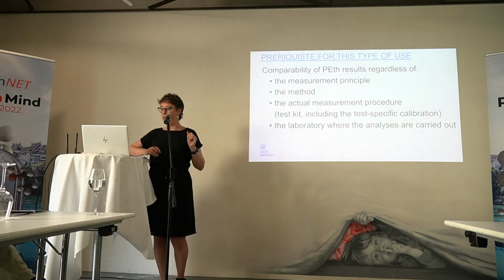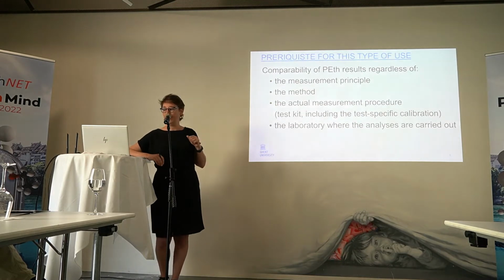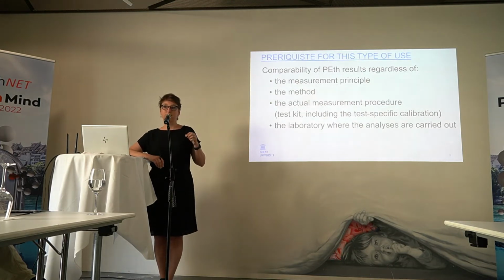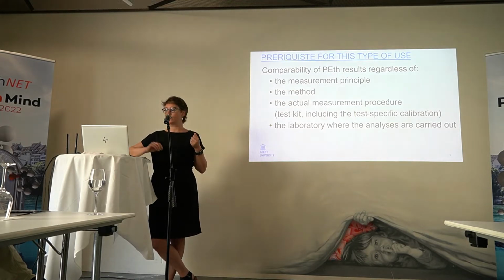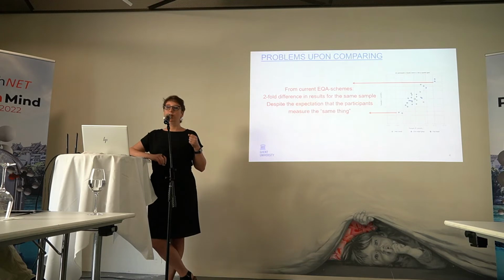And they should be comparable regardless of the measurement principle, regardless of the method that has been used, regardless of the actual measurement procedure, including the test kit and the test-specific calibration, and regardless of the laboratory where the analysis is carried out.